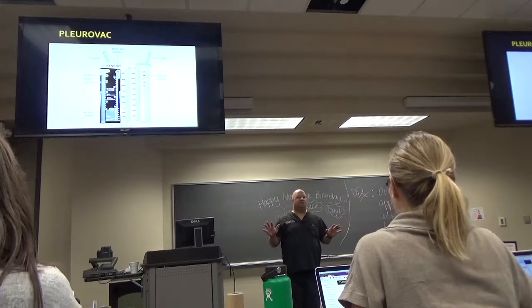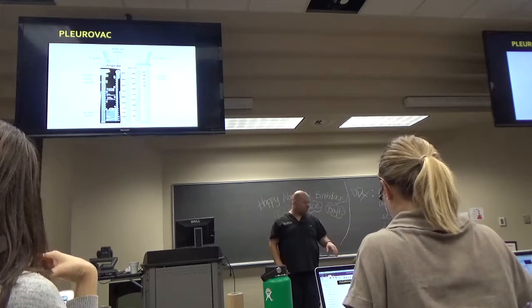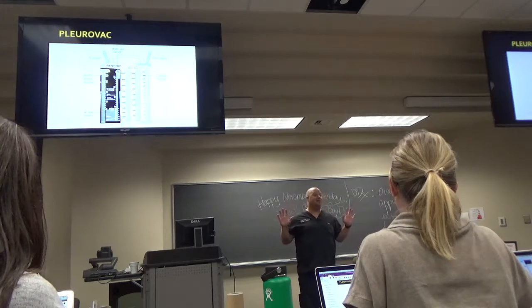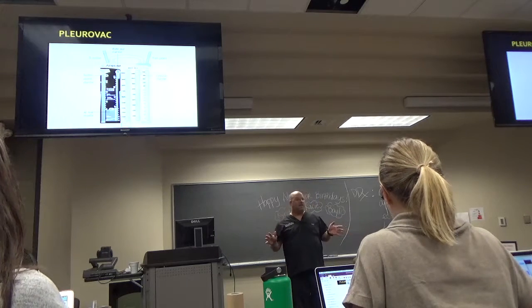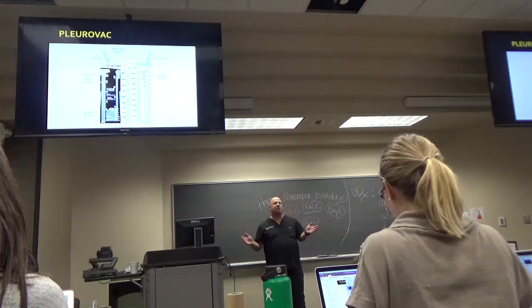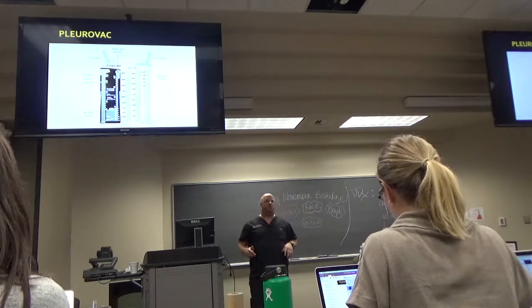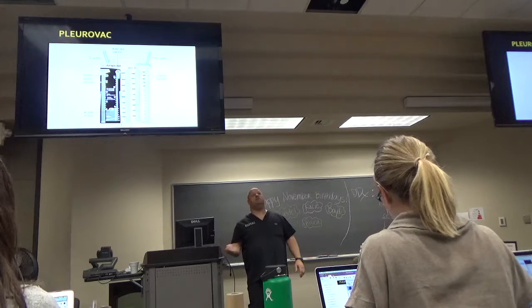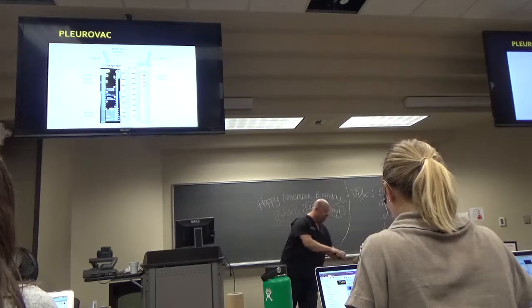I'm not relying on anybody's documentation of I&Os. I know 100%, if I saw them yesterday at 7 a.m. and I come at 7 a.m., there's 400 yesterday, 500 today, I know 100% there's 100 cc's output in the last 24 hours. It's crazy, sometimes your hospital's on divert, you're turning trauma patients away because you don't have beds, all because you couldn't send a patient home and remove that chest tube because nobody documented I&Os. Okay, you're not going to pull a chest tube out and put another one in because he's putting out too much chest drain. Does that make sense? Okay.